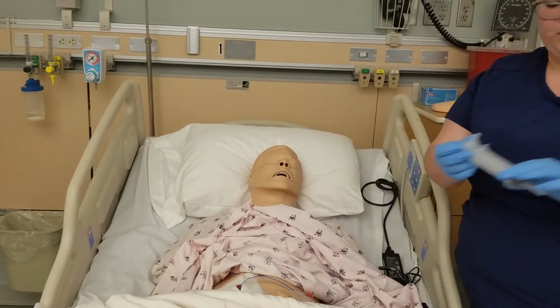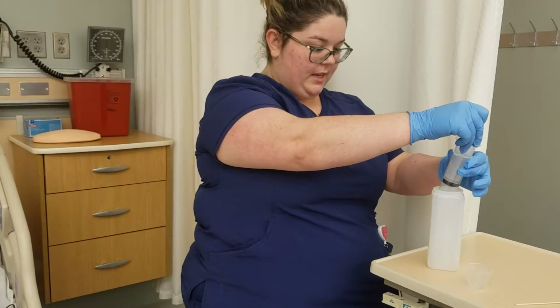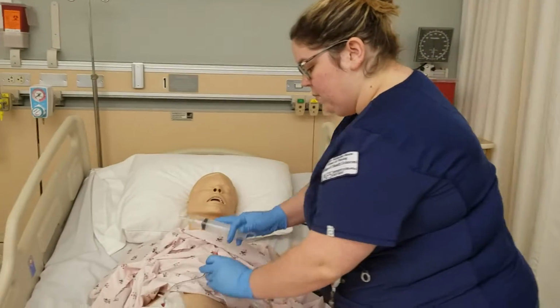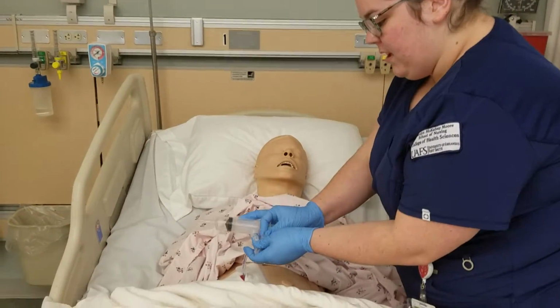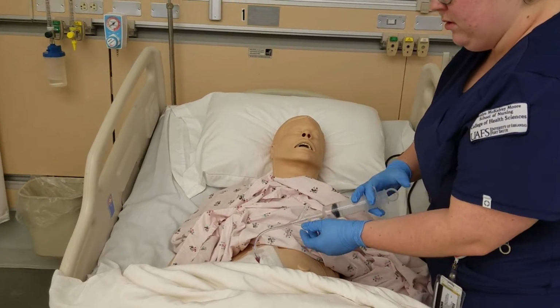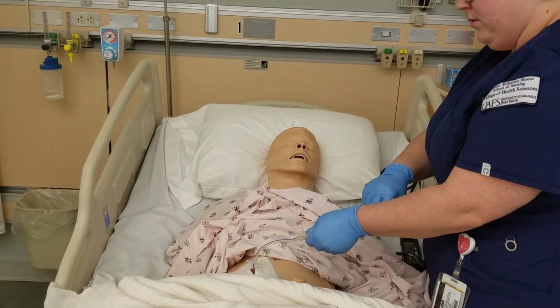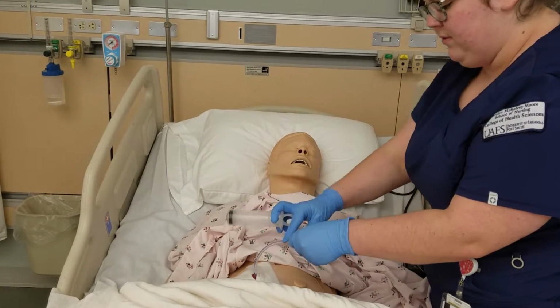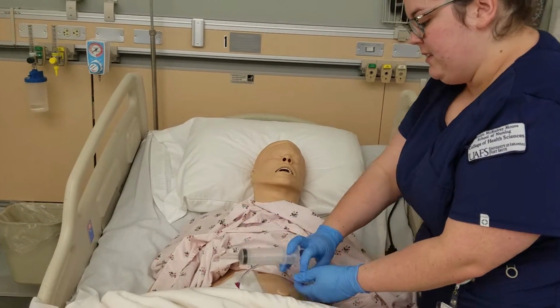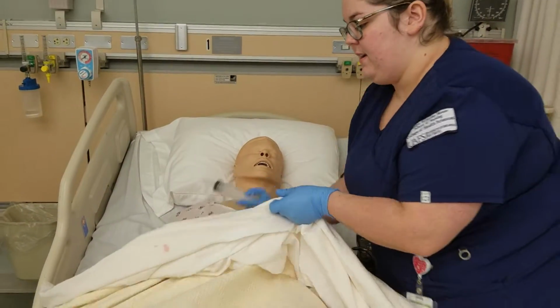And then I'm also going to draw up 20 more milliliters of water to flush my line again. Always flushing in between medications. You never give multiple medications at a time, and you flush between every medication. Once I've flushed my patient's line and it's patent, I'm going to lower their gown back.